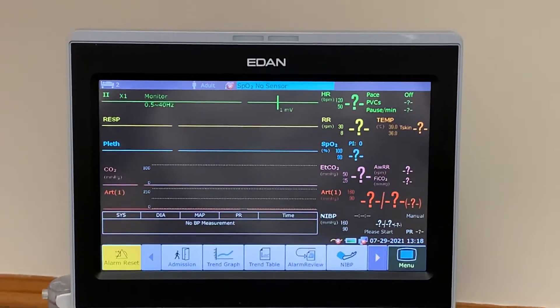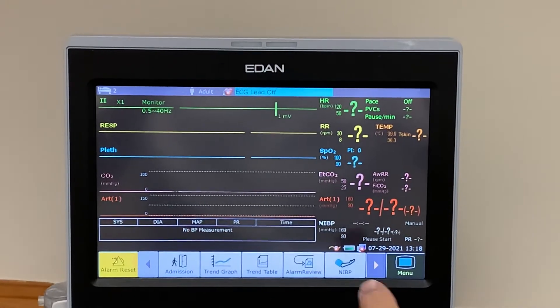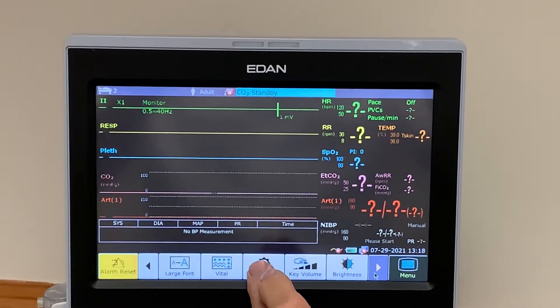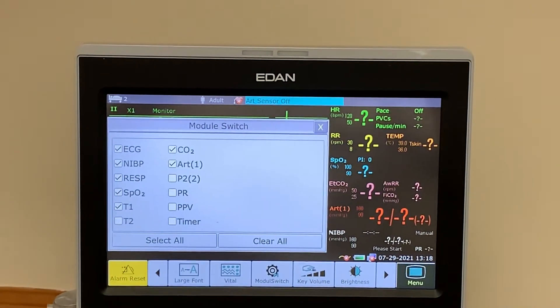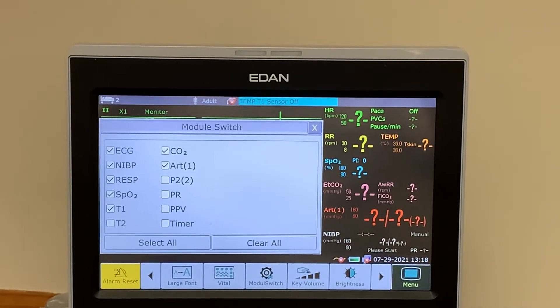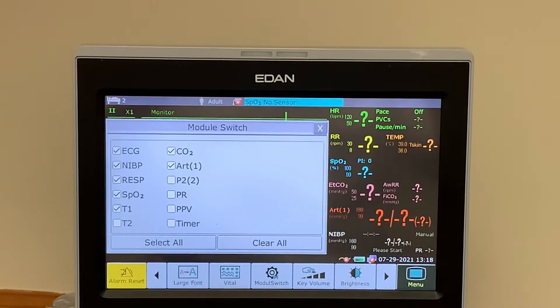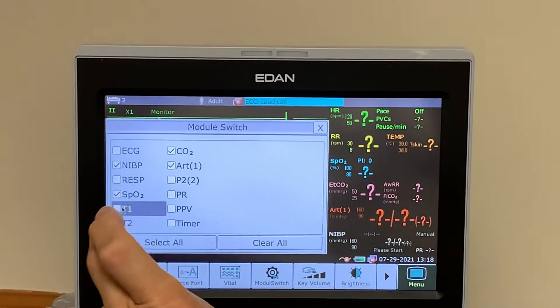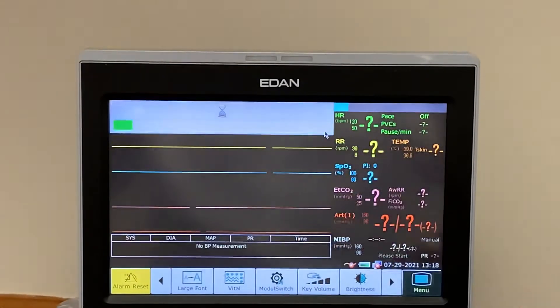I'm going to start with the first method. We look along the toolbar at the bottom and press the right-hand arrow until we see Module Switch. We press Module Switch and everything that's ticked is available to be seen on the screen. We want to remove ECG, RESP, T1, CO2, and arterial. So we untick ECG, RESP, T1, CO2, and arterial, and remove the menu.